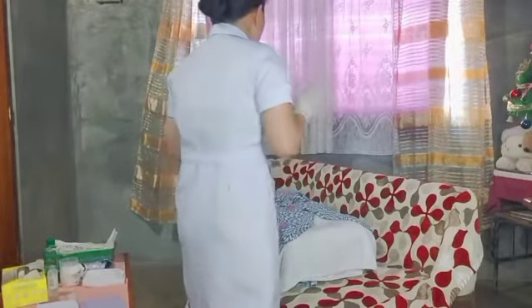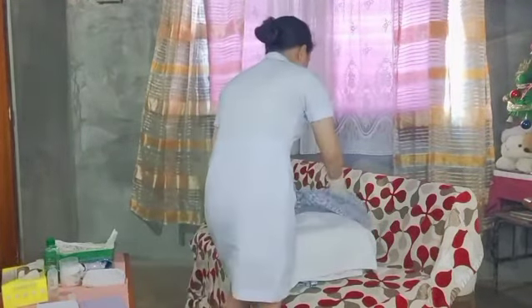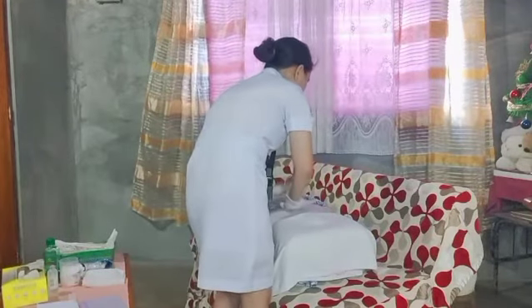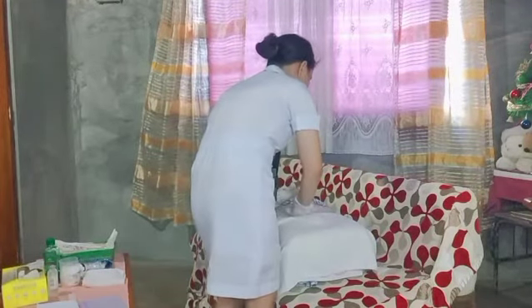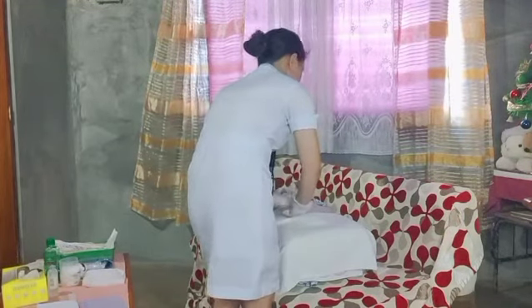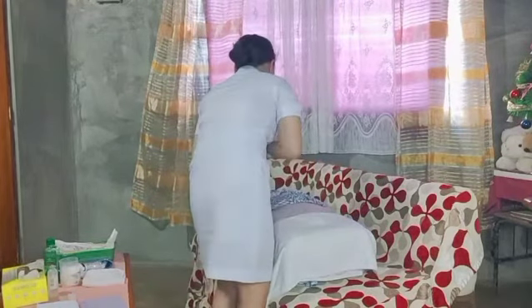Thank you, ma'am. So, we will expose your abdomen. Is that okay? We will expose it now. I'm set to percuss. Okay. We're done, ma'am.